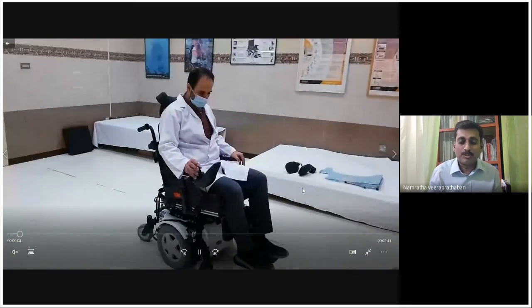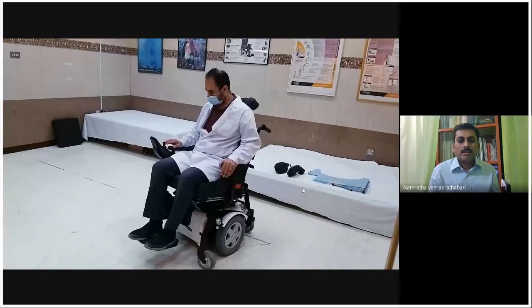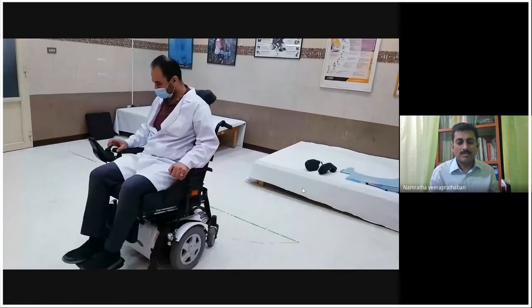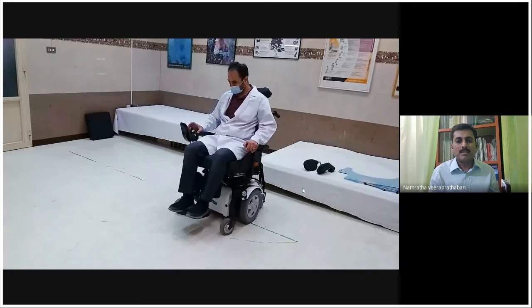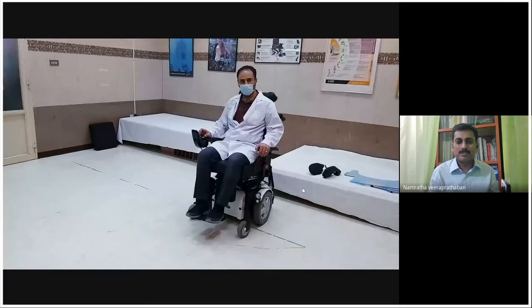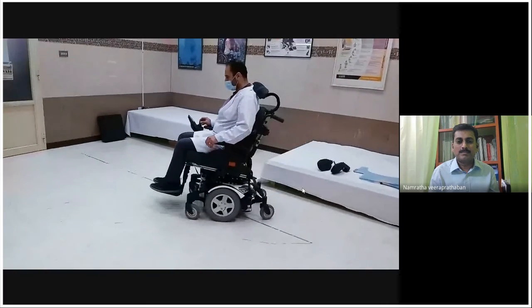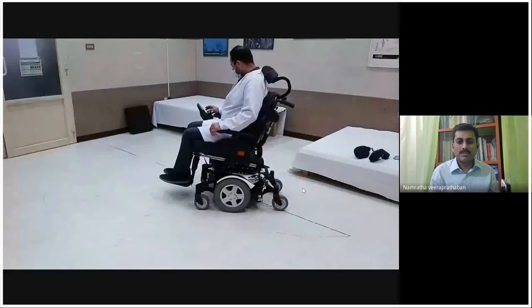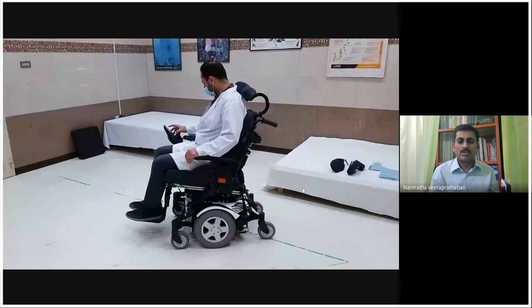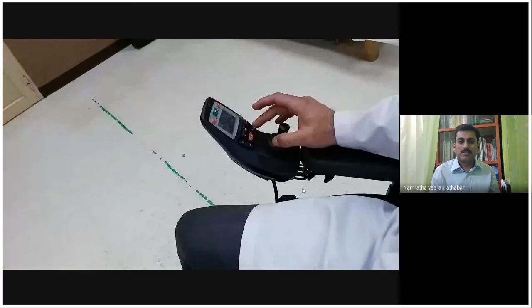I don't know how many of you have had the opportunity to see this full option power wheelchair. This is quite expensive, actually speaking. Now let's watch. Full option power wheelchair means it has power tilt, power recline, power elevating, and power lift, and you can drive the chair as well. This has 6 wheels, with mid-wheel drive. This is single joystick control. All the options you can control with a single joystick. You can choose the mode.